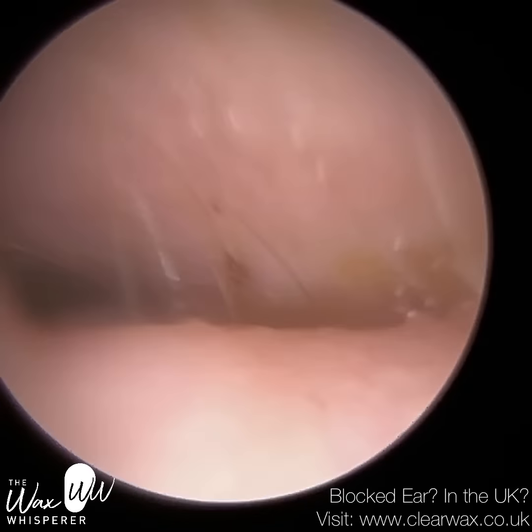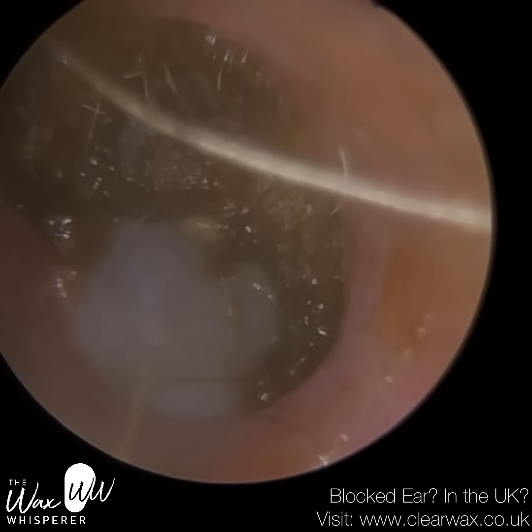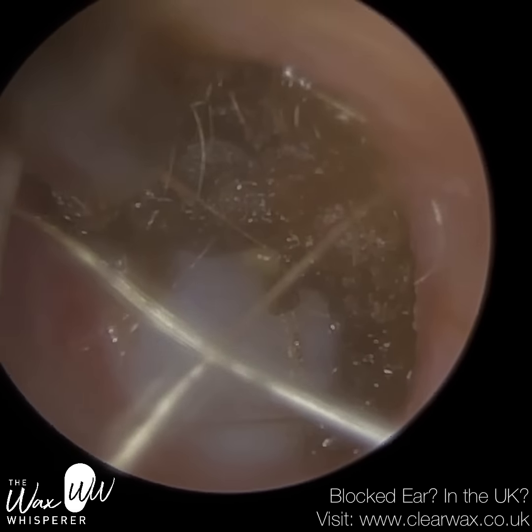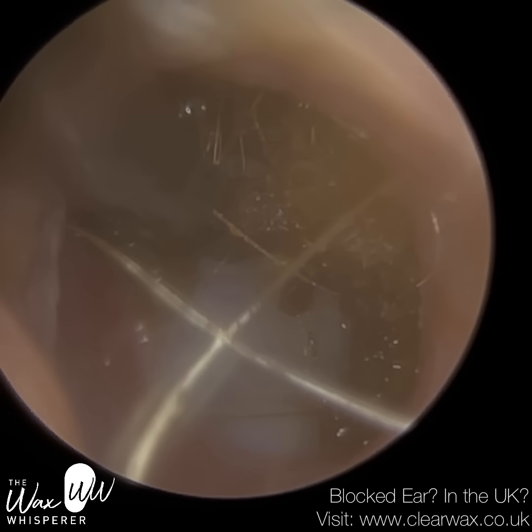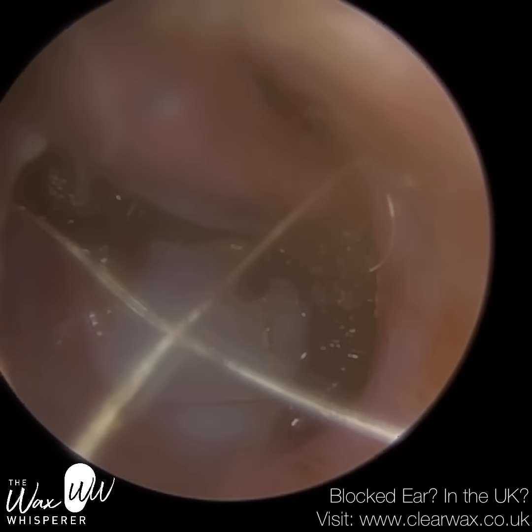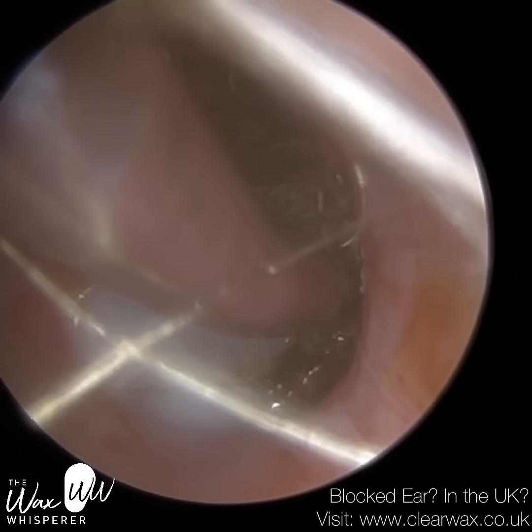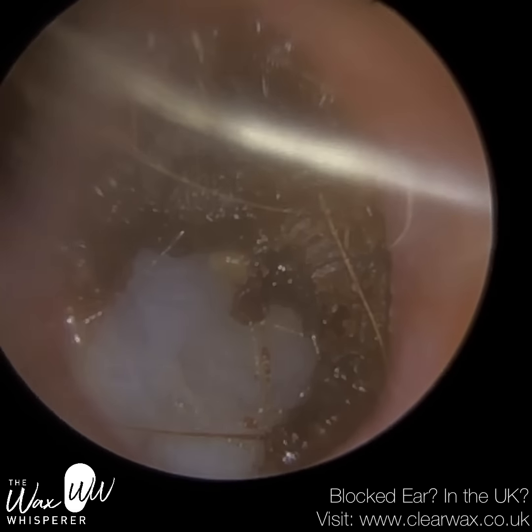You can see the wax is lodged very deep into the recesses of this patient's ear canal. I've just had to instil some more olive oil spray to remove this. I struggled to get the full Zollner suction probe in because of how narrow the ear canal is, so I'm initially using the fine end, trying to tuck this wax underneath the canal wall. The ear canal has somewhat engulfed this wax — trapped it. What I'm trying to do is bring this wax down and under the roof of the ear canal to extract it. I've now refocused to the anterior recess, and I've had to curl and bend the tip of the fine end to get access into it.